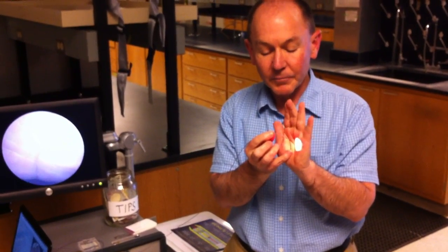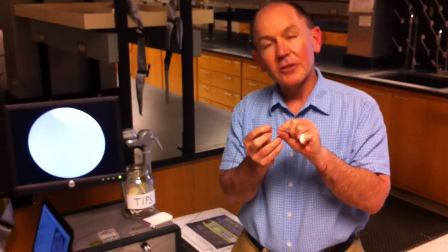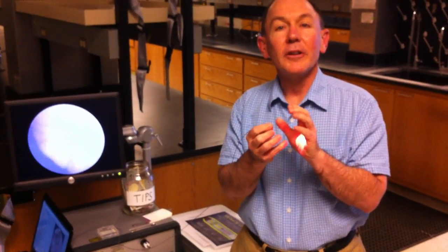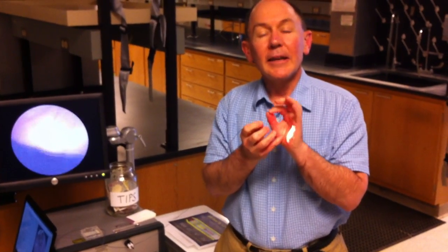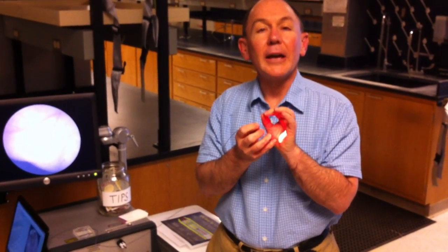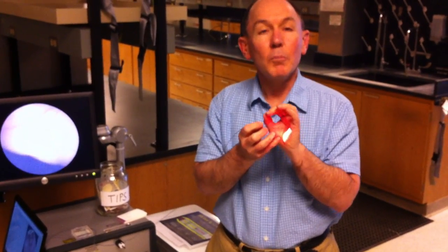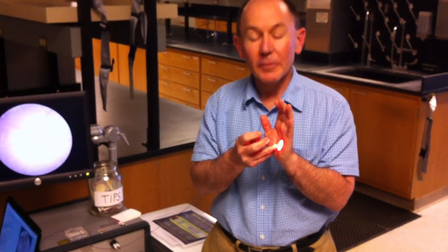And it uses a totally different technique. Instead of a camera chip in it, it has a single optical fiber that then vibrates. It uses lasers to output light, and that lights up one spot at a time. The reflection from that then is picked up, and we move the fiber, which moves the spot, and then we generate an image over time.